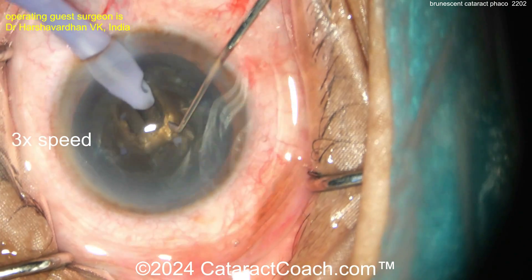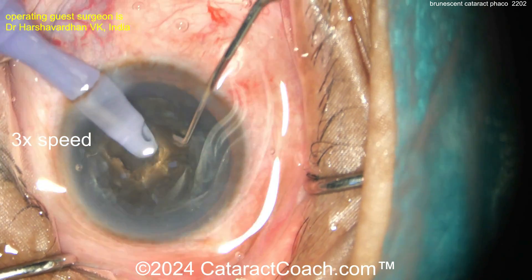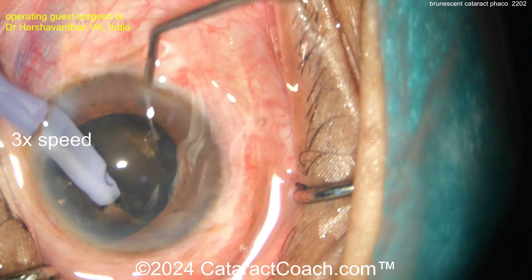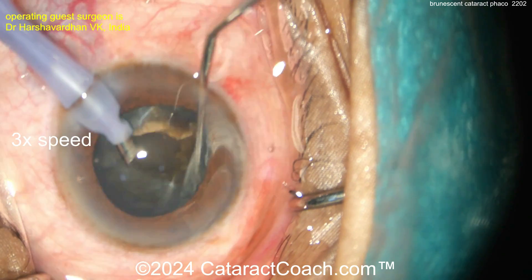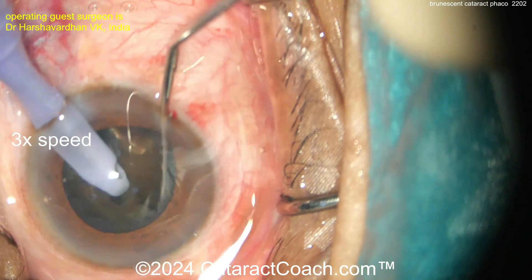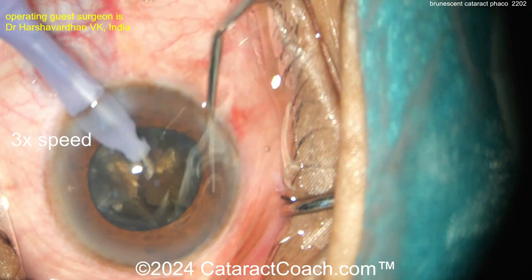Viscoelastic is great — cheaper than vitreous and cheaper than endothelial cells. Phaco probe going in, deep chop, chopper going in. Notice how the two halves don't want to separate — that's typical. These brunescent cataracts have fibers at the posterior plate and become very difficult to separate.